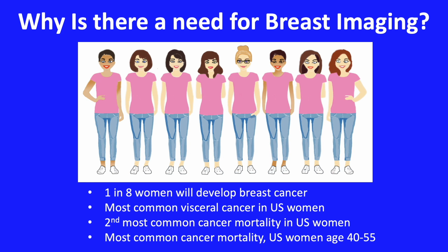When there is a clinical suspicion of breast cancer, definitive diagnosis of benign and malignant disease is almost always dependent upon radiological imaging. But more importantly, screening of asymptomatic women for this disease has been shown to reduce mortality from breast cancer.